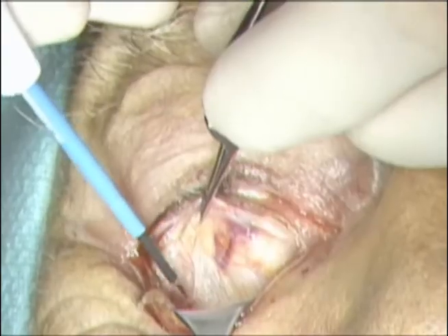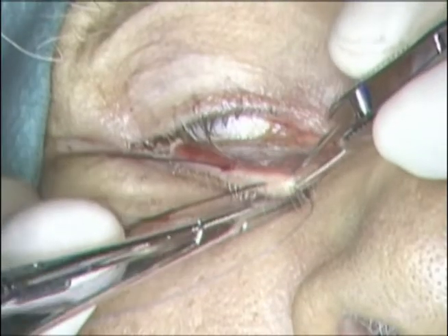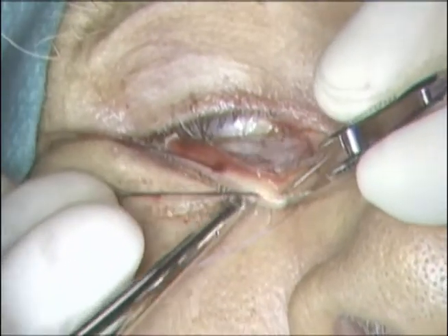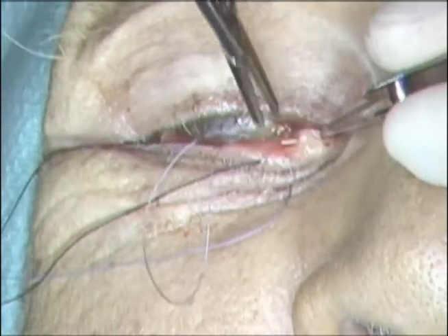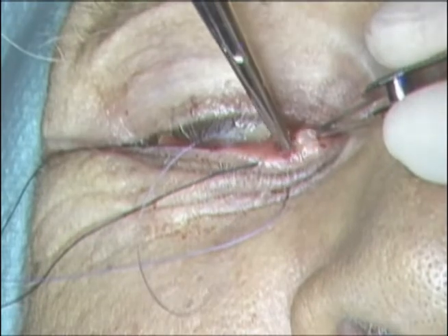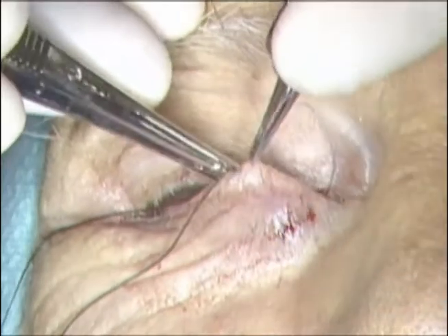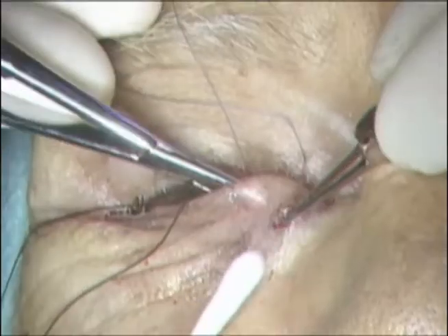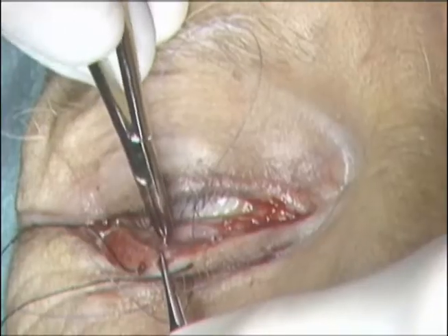Dissection is then carried out between the orbicularis muscle and the orbital septum to the inferior orbital rim. Using a 5-0 Vicryl suture, inverting sutures are placed. The suture is placed transcutaneously approximately 1 cm inferior to the inferior border of the tarsus to exit out the orbicularis muscle. The suture then engages the inferior border of the tarsus.